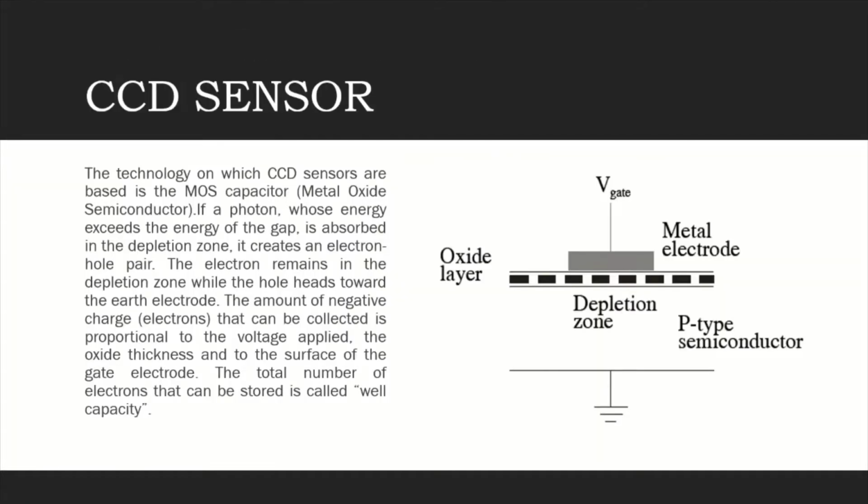In this part of our presentation, I'm going to talk about CCD and CMOS sensors. Our first sensor is CCD. With the appearance of semiconductors, the first CCD sensors appeared in the 1970s, and the advances made in physics of solids as much as electronics have made it possible to have simpler and more efficient manufacturing processes.